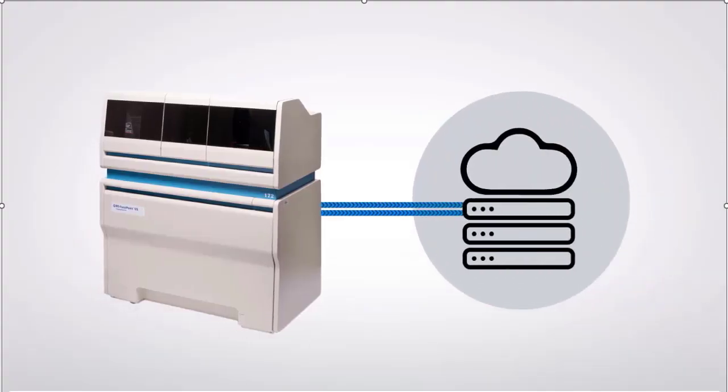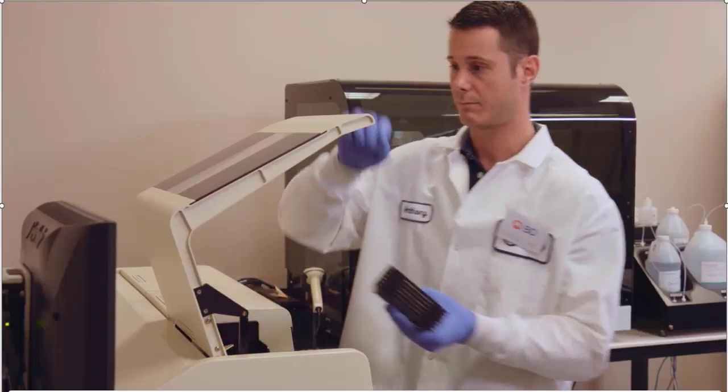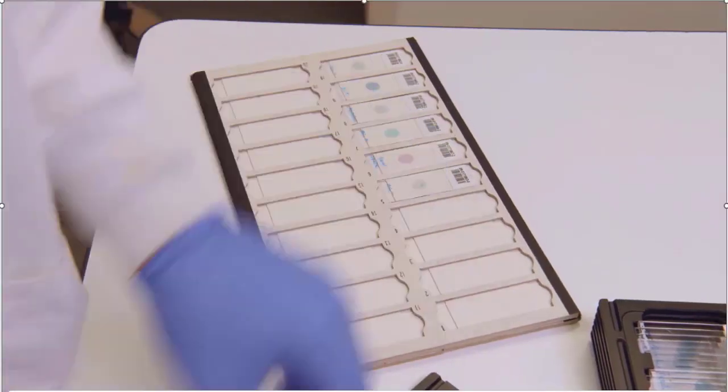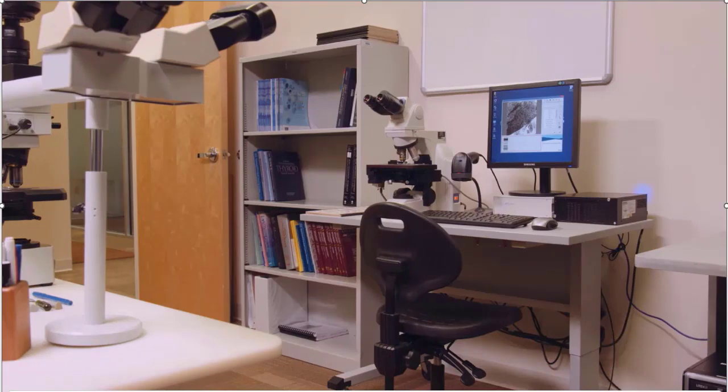Once the imaging is complete, the data for each slide is transferred from the BD FocalPoint slide profiler to a central server where it is stored. Slides are removed from the output hopper and put into trays for screening and delivered to the GS review station microscope area.